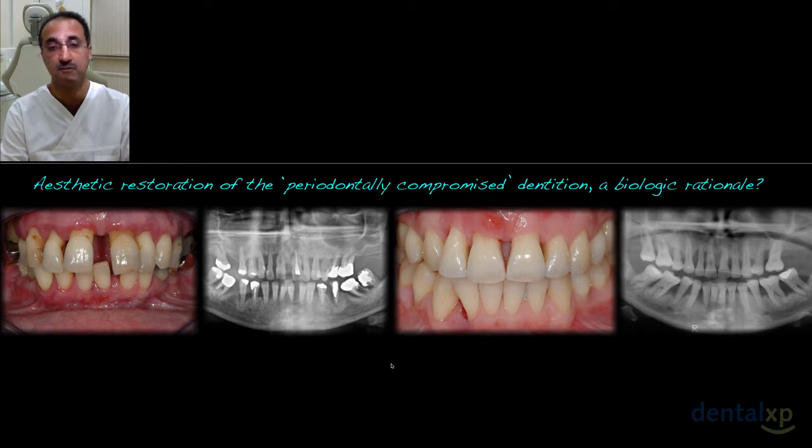The patient on the left is 50 and the one on the right is 38. And of course, the patient is then going to have prosthetic gingiva and potential issues with cleaning being more difficult, maintenance being more difficult, and also phonetics being quite a challenge in some of these patients with large one-piece frameworks.